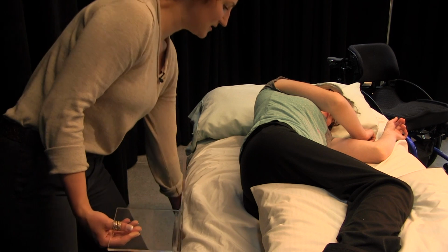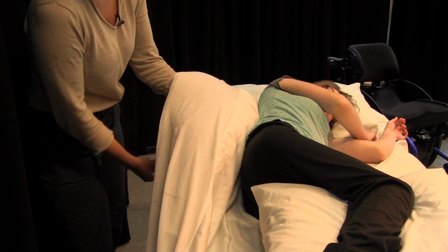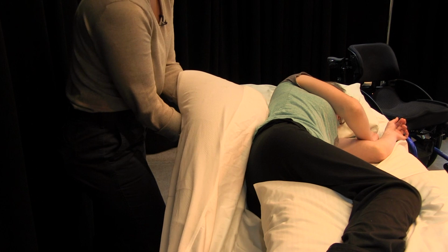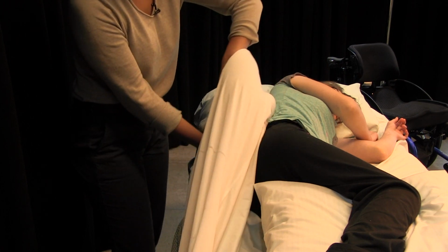This support should be sturdy and placed between the two non-slip layers so that the user can lean against it without it sliding away from their back. So we're putting it between these two non-slip layers here.